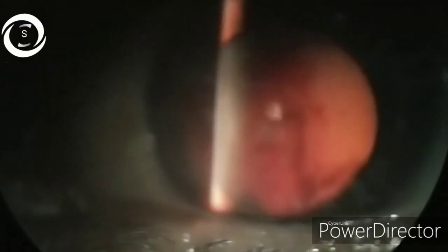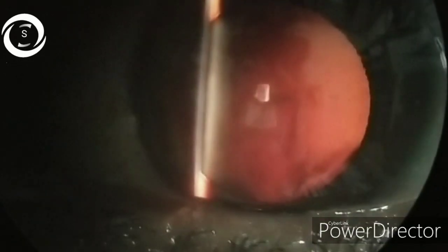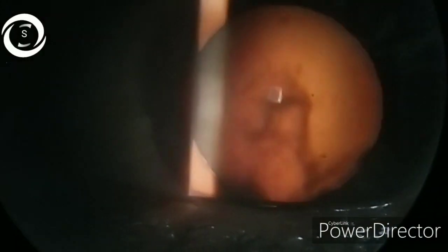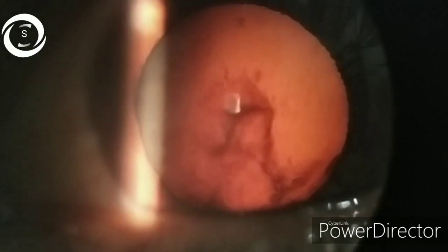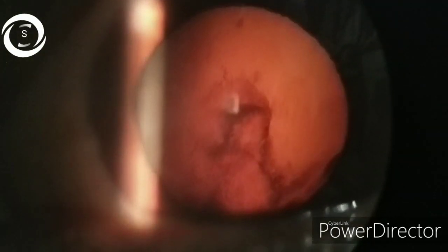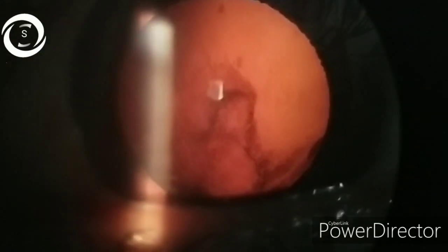Here you can see an oblique illumination of a posterior subcapsular cataract, but when retro illumination is performed, you can see this wine glass-like posterior subcapsular cataract. So how beautifully these opacities are highlighted on a retro illumination technique.